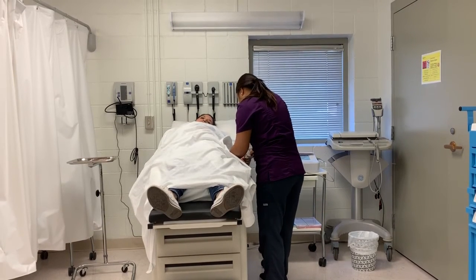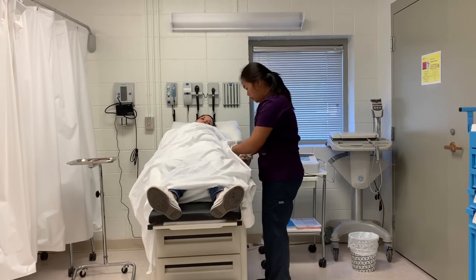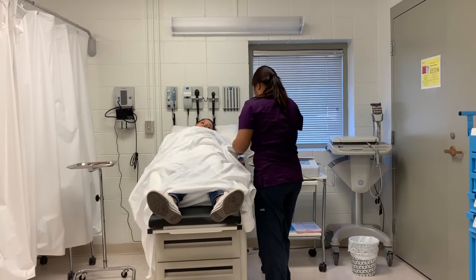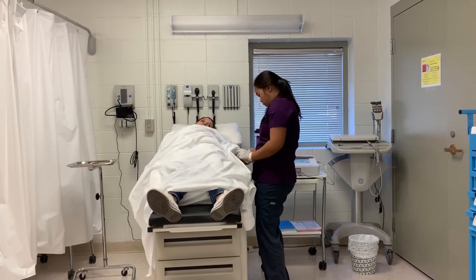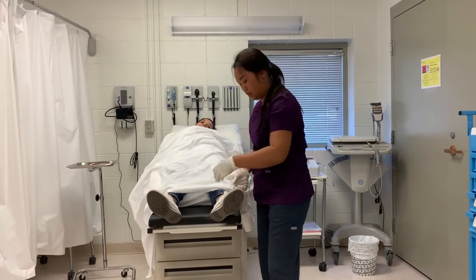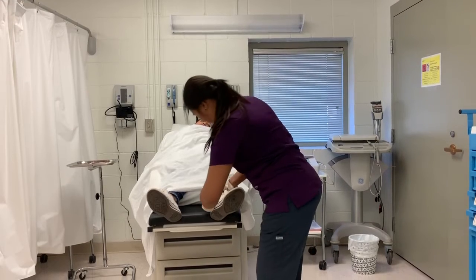While you're pulling the electrode, you want to make sure you pull the top of the skin so it doesn't hurt the patient or pull any skin. And it's good to stick them on your gloves so you can count how many electrodes you placed, so that the patient doesn't leave with one.